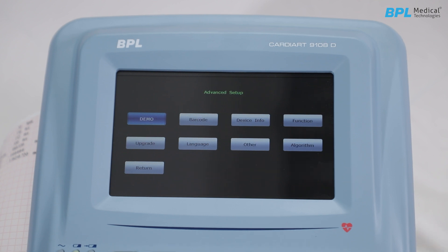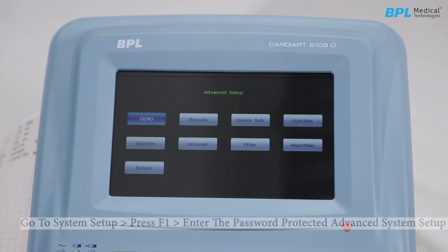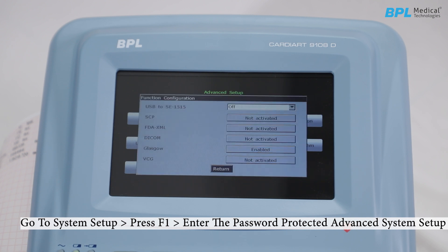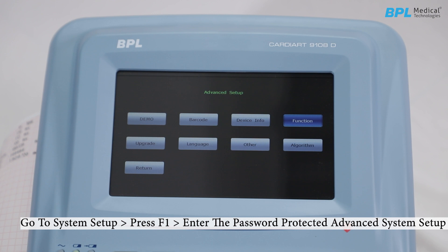For a quick look at the advanced setup, go to system setup and press F1. You will be able to view the machine configuration and settings in detail, including demo mode, barcode, device information, and functions. Configuration options include upgrade option, language, and other algorithms.